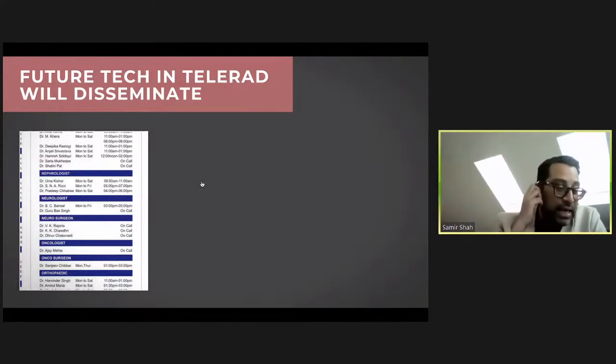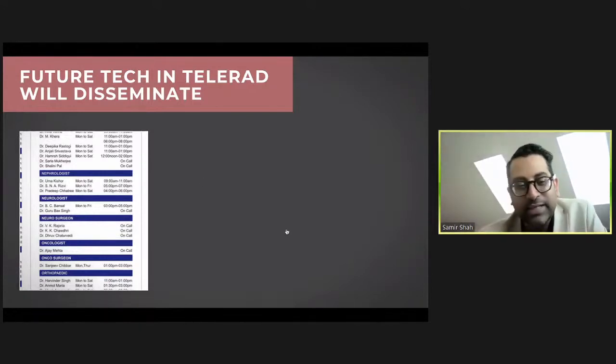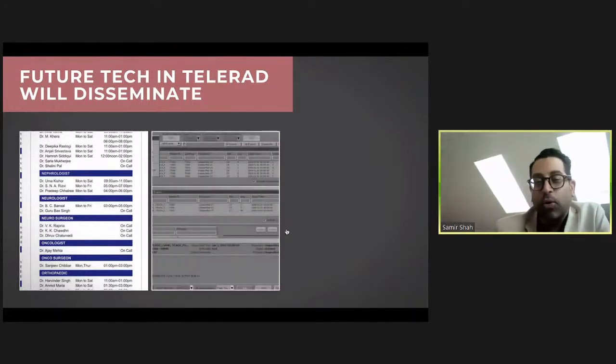As we see different AI use cases, I definitely see more and more automation of critical reports and critical findings. It's definitely being automated more and more. Another thing I see is we all work with work lists as radiologists. Everybody sees a work list and kind of decides what's their next case and picks it, and it opens up. I see it all going away with AI and teleradiology. Really, it's already started, but generally the algorithms will pick the best case.